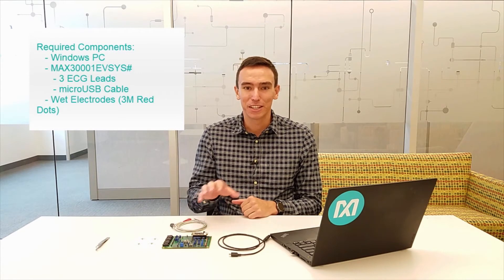To get started you'll need a PC, the evaluation system with the included ECG leads and micro USB cable, and some wet electrodes like these 3M Red Dots.